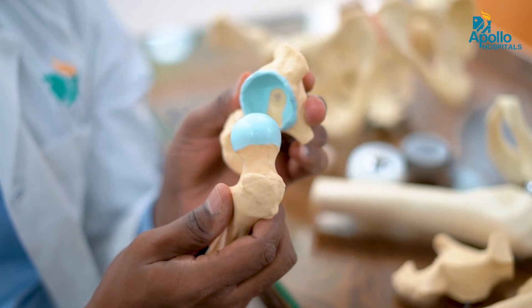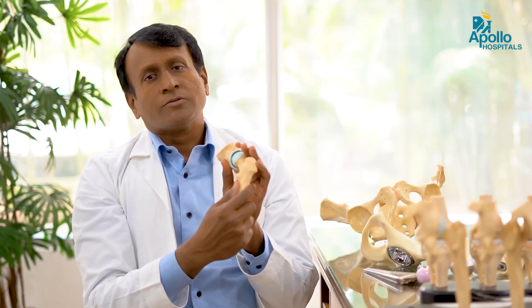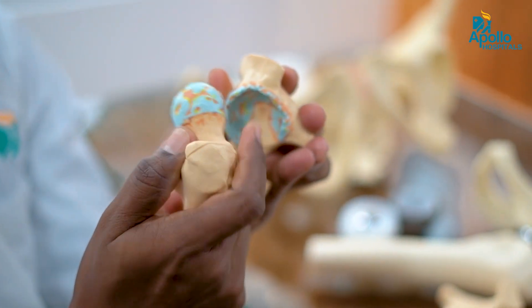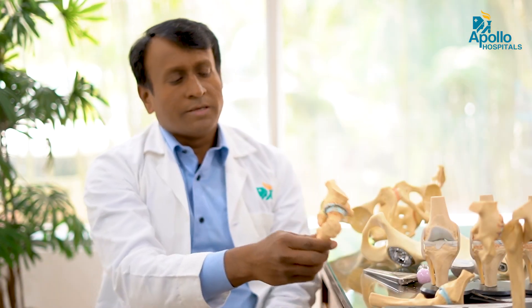So this is the hip joint. You can see this is a ball and socket variety. This is the cartilage. In arthritis, the cartilage is completely damaged. There are different ways of doing hip replacement, as we can see.